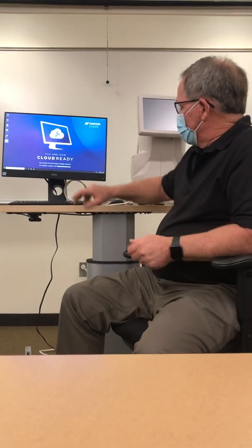Yep. It's a 45-degree camera, so the round fundus photo you see is 45 degrees. With 3 of those going out, it's half again as much, so about a 90-degree angle. Real simple to use. The screen is a touch screen, but we're going to use the mouse.